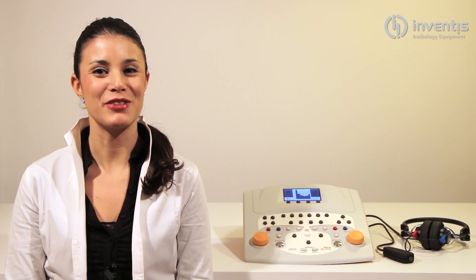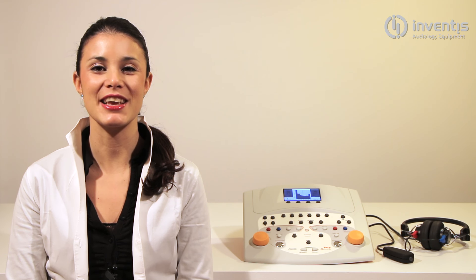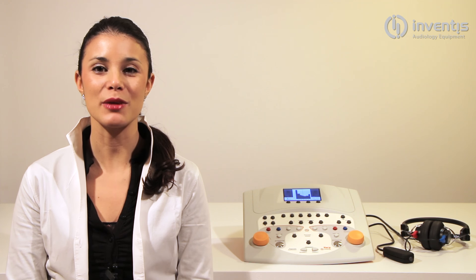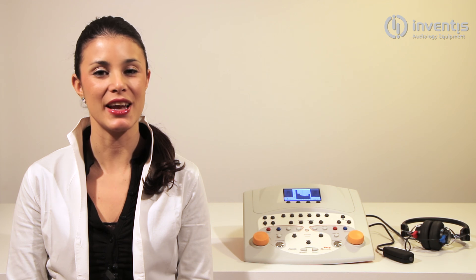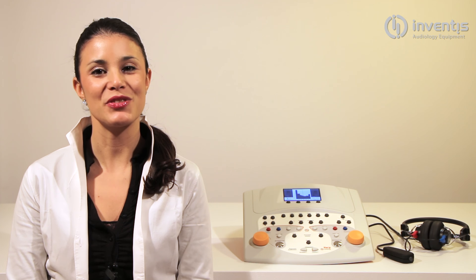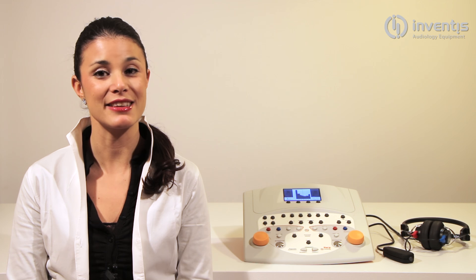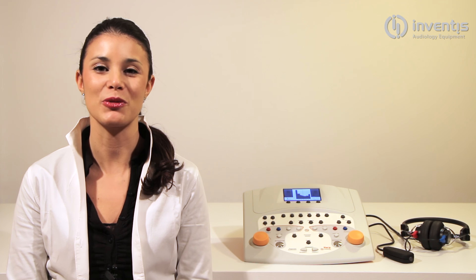Welcome to the Inventis HAARP tutorial video series. I'm Nicole and I will give you the features and use of our diagnostic audiometer. On HAARP, pure tone exam is available via air and bone conduction or through free field output. During this video we'll have a look at the available settings and how simple it is to carry out a pure tone audiometry test.